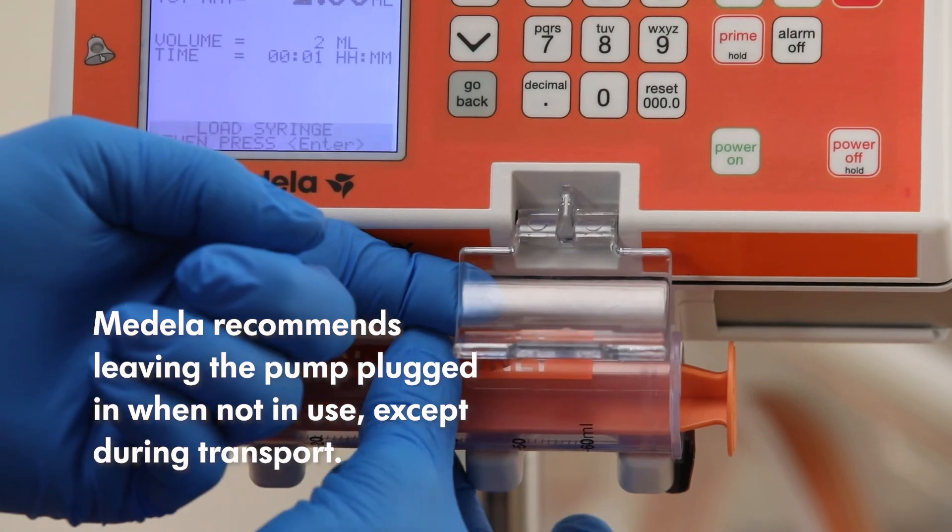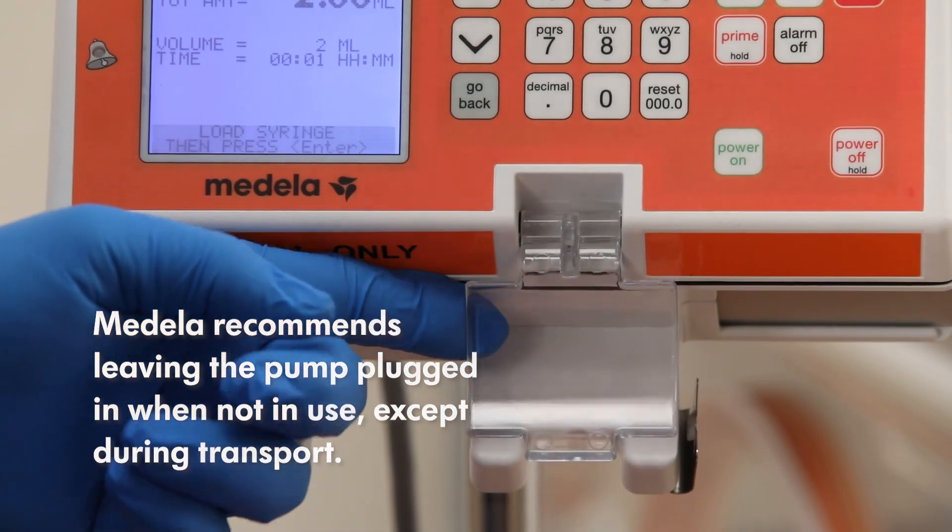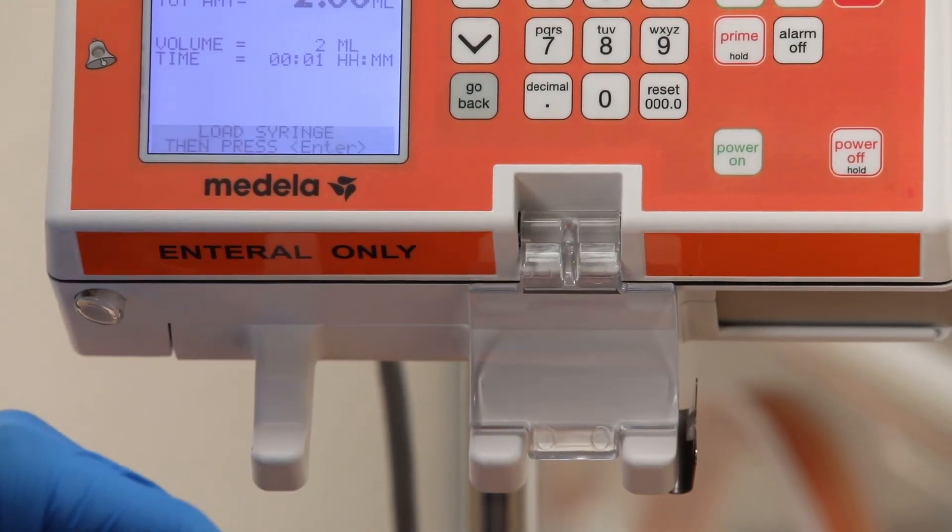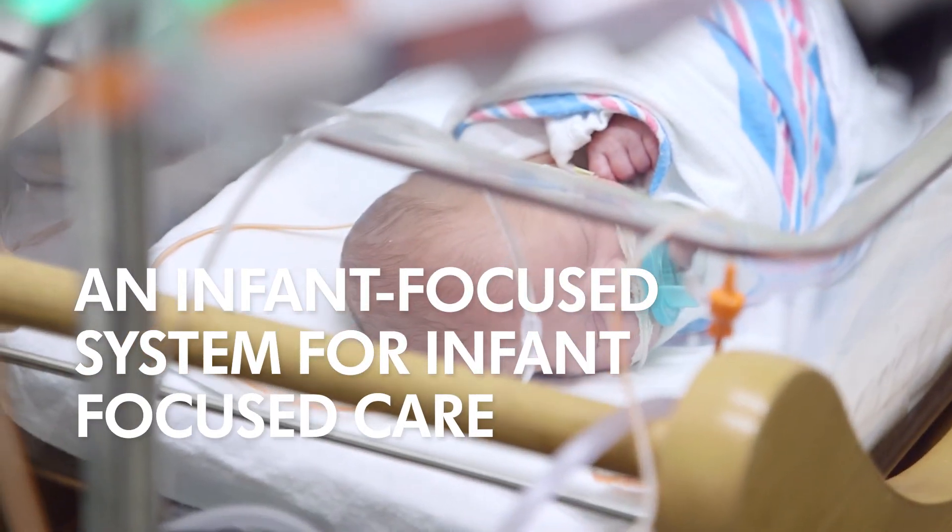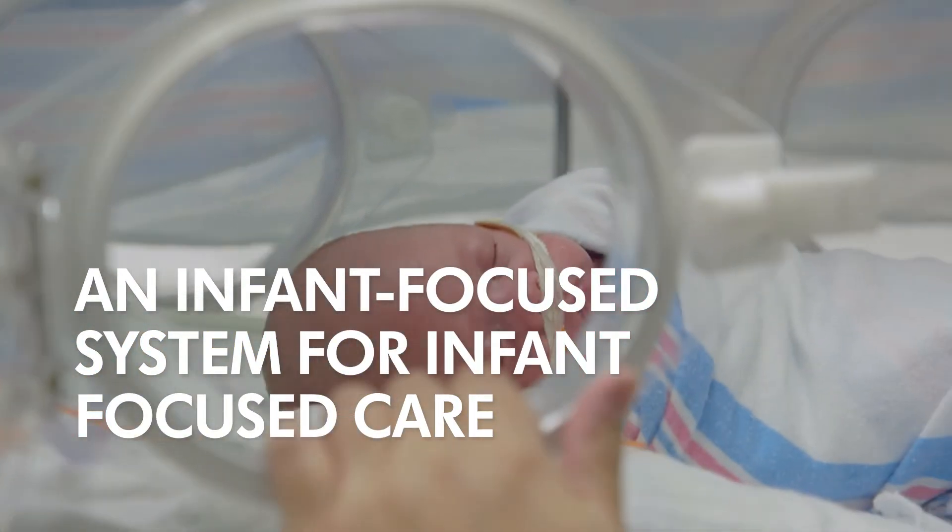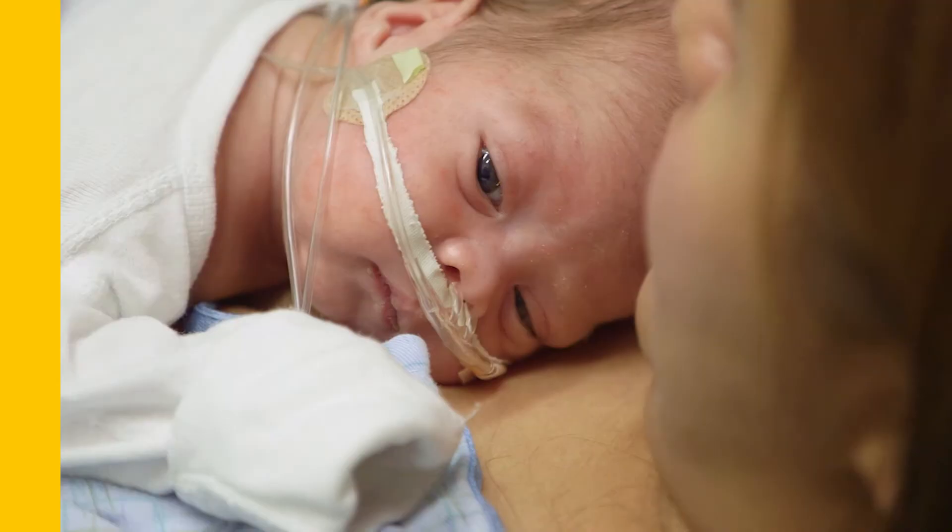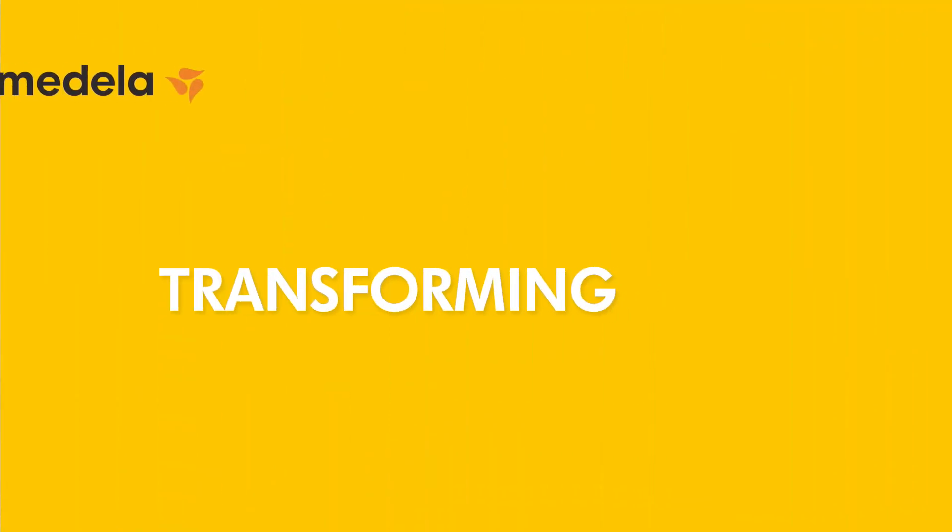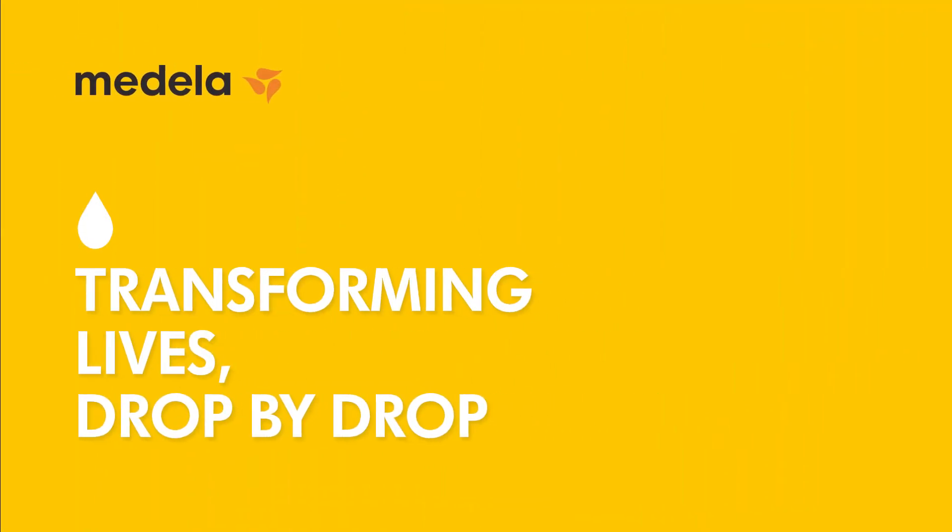Medela recommends leaving the Enteral Feeding Pump plugged in when not in use, except during transport. Tailored to meet the unique needs of neonates and built for the demands of the NICU. Because nowhere is the power of human milk more apparent than in the NICU. It's where drops save lives and small details matter.